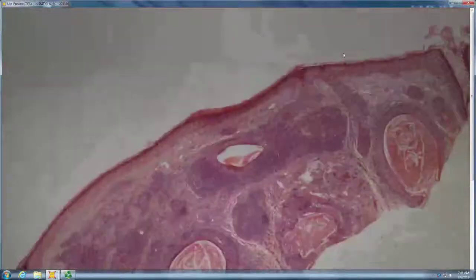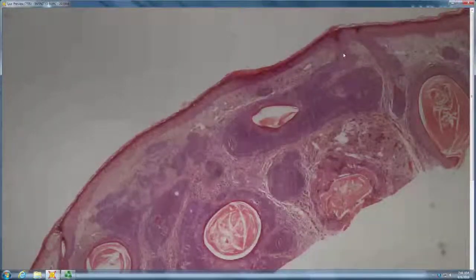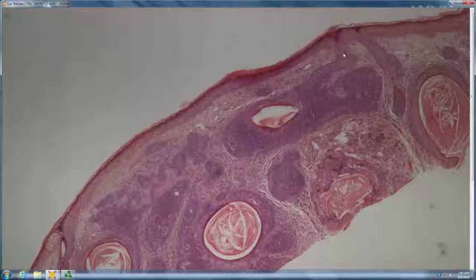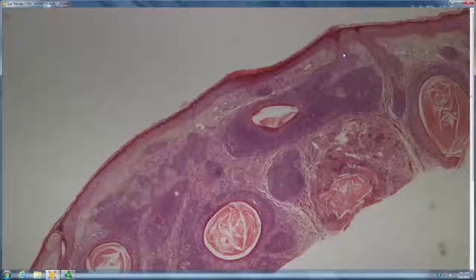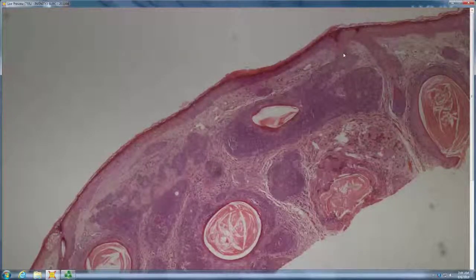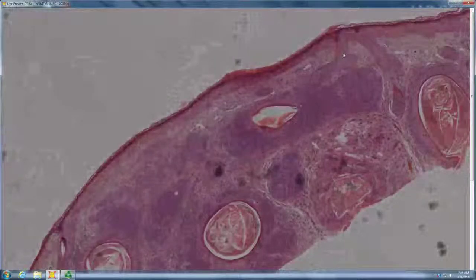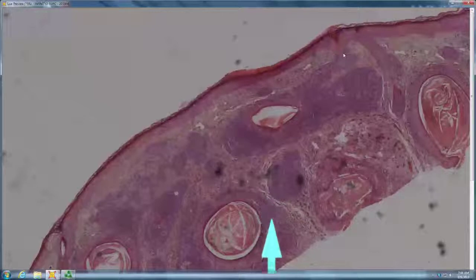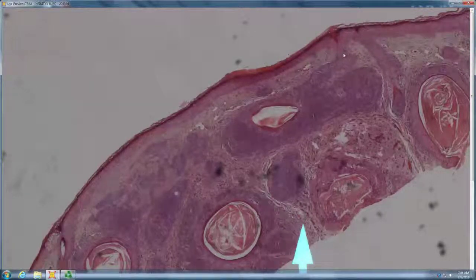Okay, that's your biopsy. So these are basaloid cells in the dermis. So basaloid cells, so it's a basal cell carcinoma, right? No, I don't think so. So why not basal cell carcinoma? These white spaces are after the collagen rather than between the basaloid cells. Correct. There's no retraction space adjacent to the epithelium. It's all splits within the stroma.